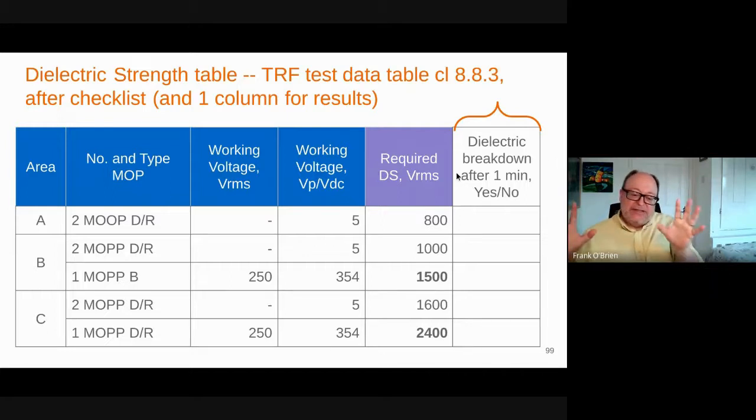And sometimes in the test report, I'll have in the remarks, there's sort of a notes or a remarks column for the insulation diagram table. I'll put the dielectrics in there. So somebody looking at the beginning of the report can kind of see that in 883, there'll be these values. I think it's helpful, but it wouldn't be required.